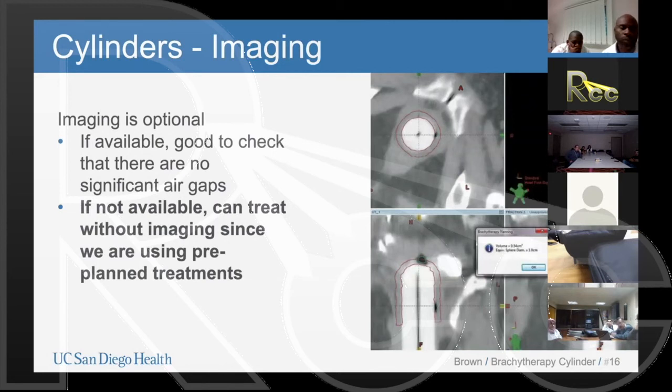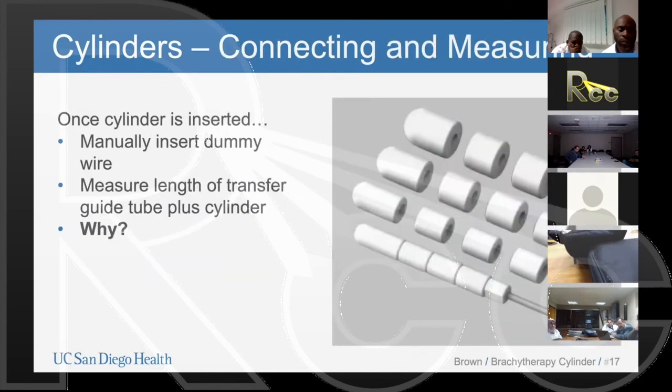Most places, again, will not use imaging for cylinders. We're using pre-plans, so we don't need to digitize every single time we treat. So we can definitely treat without imaging because we're using pre-plans.